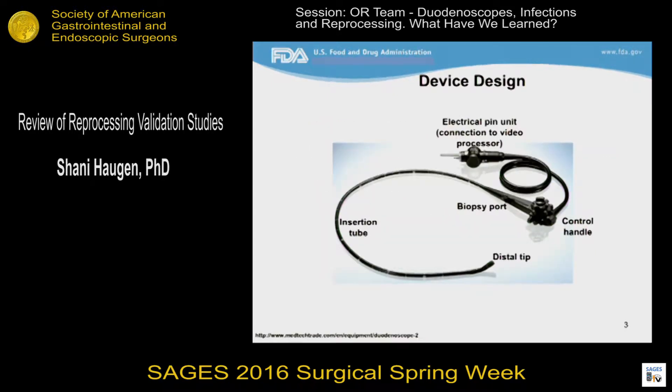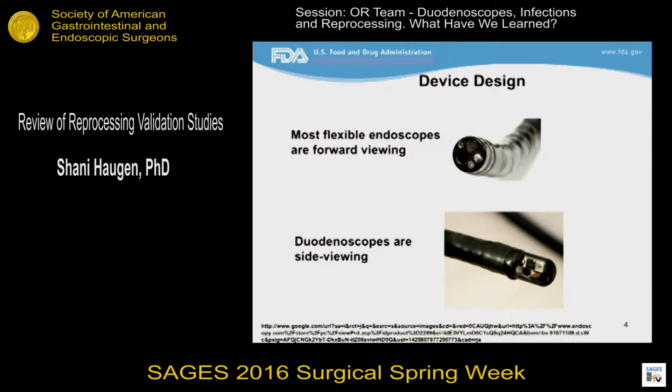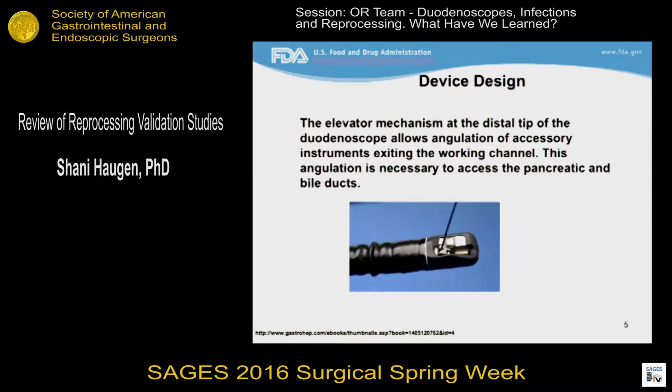For the device design, I'm mostly going to be focusing on the distal tip of the scope, which is the part that is first inserted into the patient. Most flexible endoscopes are forward viewing, but duodenoscopes are side viewing, and they have an elevator. The elevator mechanism allows deflection of instruments exiting the instrument channel. When raised, the elevator changes the angle of accessory instruments up to a nearly 90-degree angle or perpendicular to the scope, and this angulation is necessary to access the pancreatic and bile ducts.